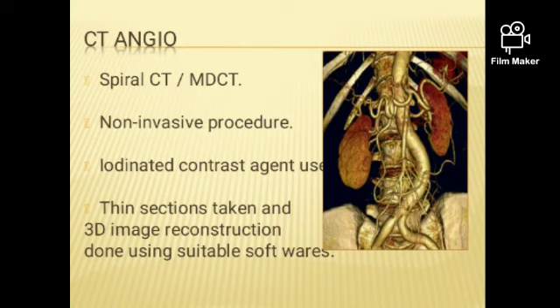Even 3D reconstructions and volumetric studies can be done, and that is what we have in CT angiography. Small stenoses are seen, everything is a clear image, and the patient is comfortable. Then you need pre-preparation and post-preparation: just check the urea and creatinine level and history. Then inject the contrast media, take a shot; arterial and venous phases and delayed phases are required. Then ask the patient to go home safely, comfortable, life saving, time saving, with less radiation dose. This is our CT angiography.